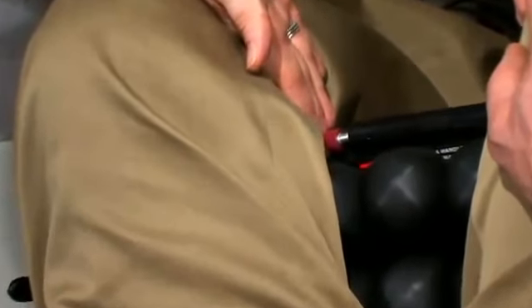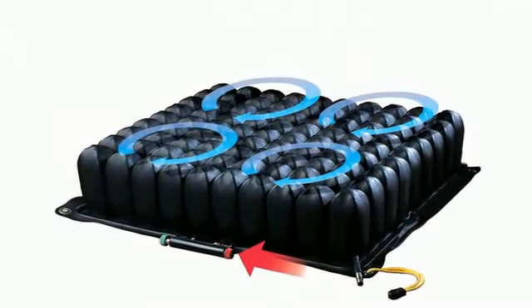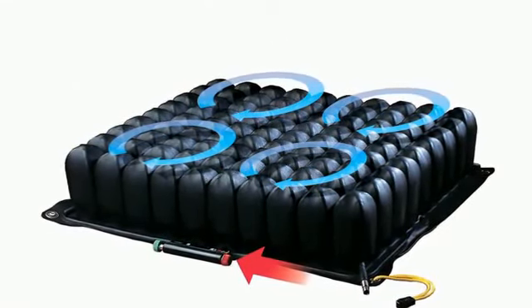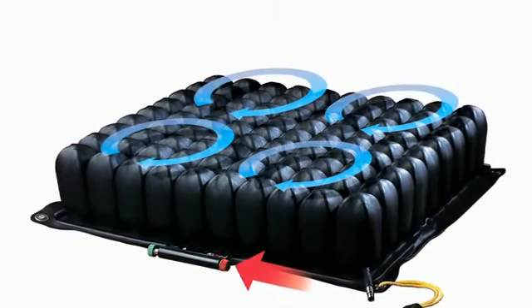When you lock the isoflow by pushing the red knob in, the air is then locked into the four quadrants. This means that the air in each quadrant is only able to travel within the few cells of that quadrant. The air no longer travels from left to right or front to back with client movements, providing inherently more stability and less air fluctuation.